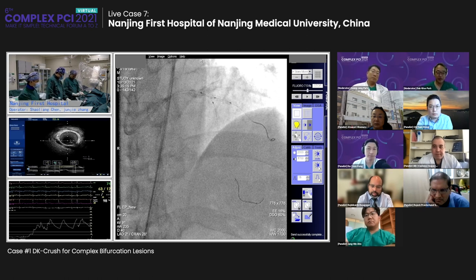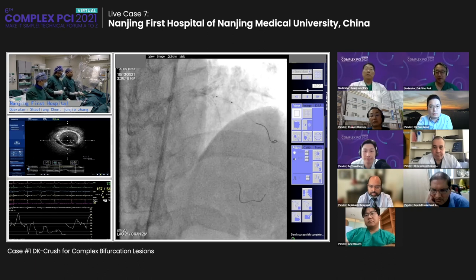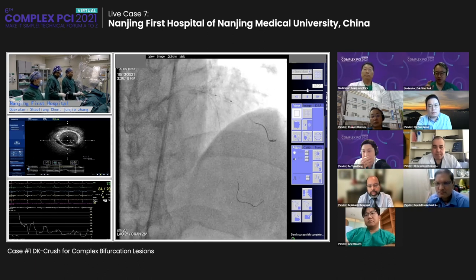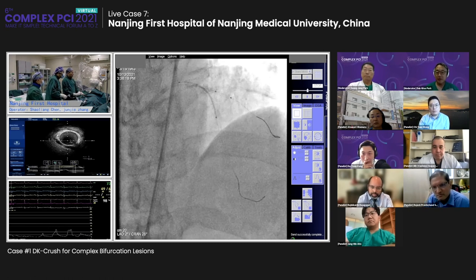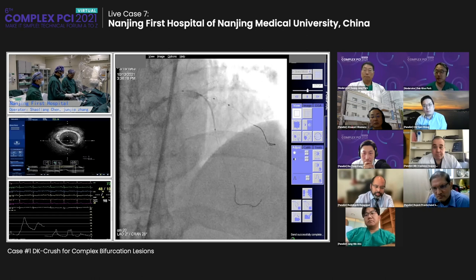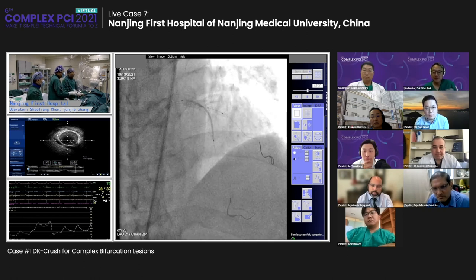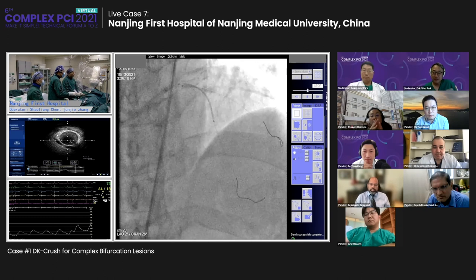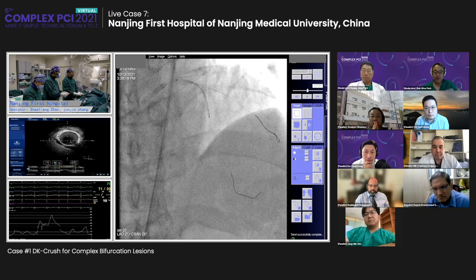Definitely. I fully agree with your opinion. Sometimes the 38 mm, the longest stent, does not pass. We should consider two shorter stents. Exactly. Okay, great. No problem. Wonderful. Thank you. Now I can very safely and comfortably remove the side balloon and also the diagonal wire.